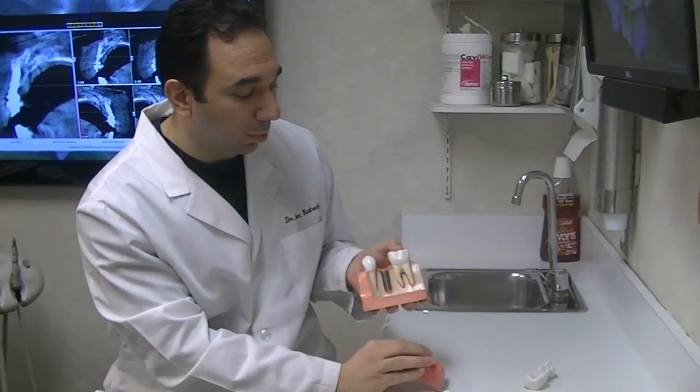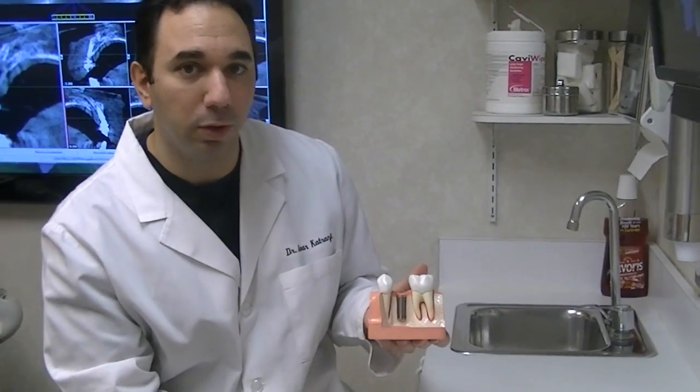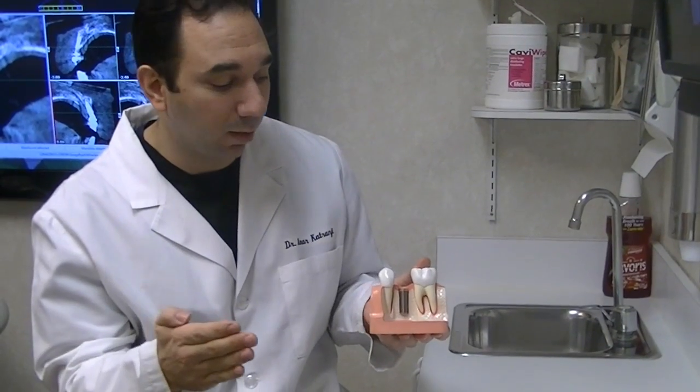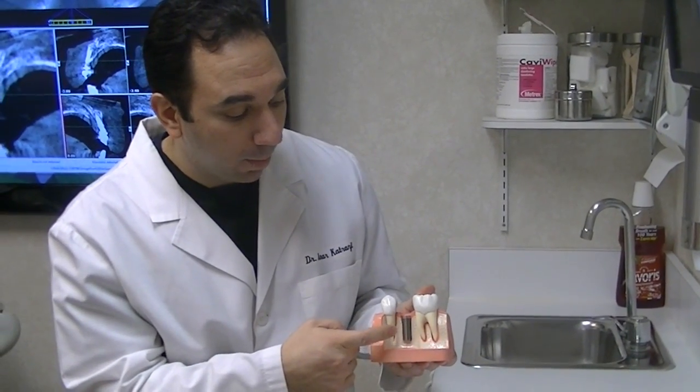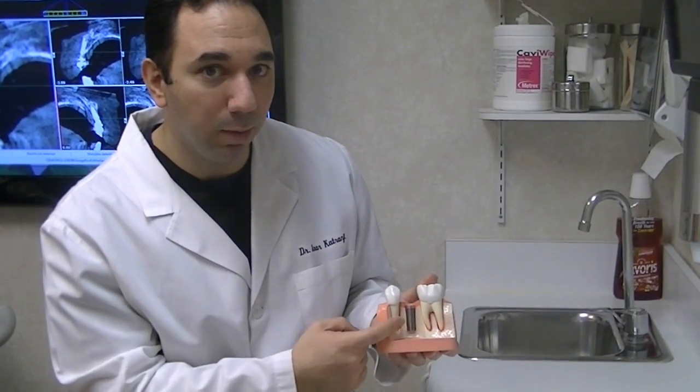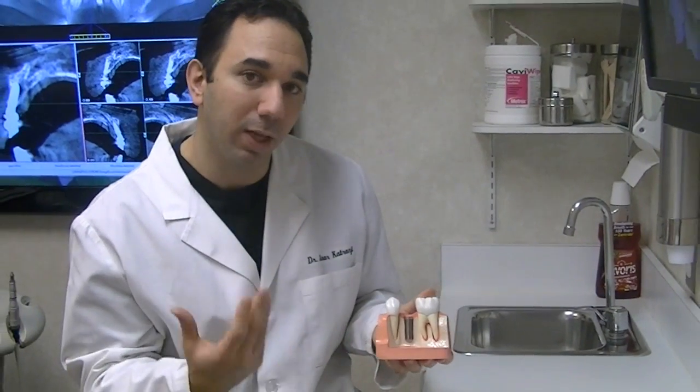The implant replaces the root of the tooth. The implant looks like a screw, but it works like the root of the tooth. That bone loss that occurs happens when you lose a tooth because the root is gone. The implant will work like the root and preserve the bone. When it goes in, it also takes about three months to anchor into the bone.